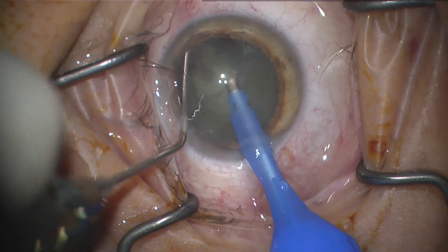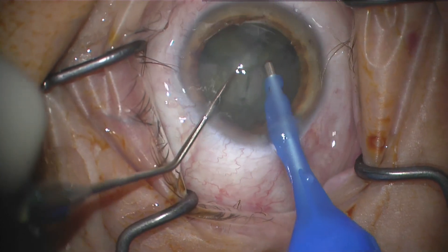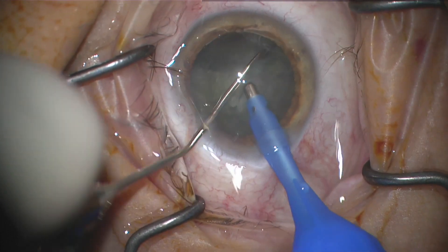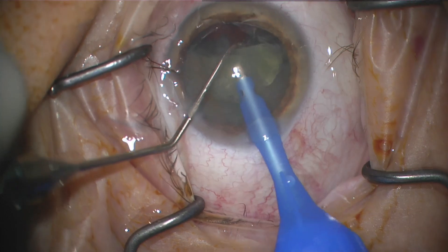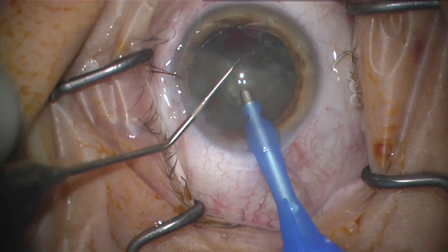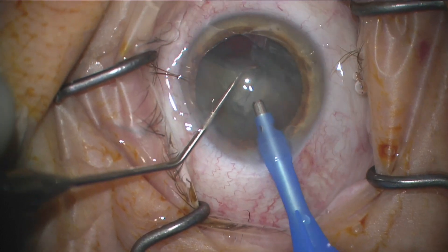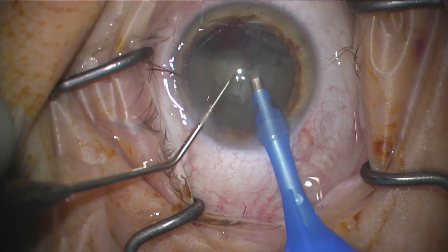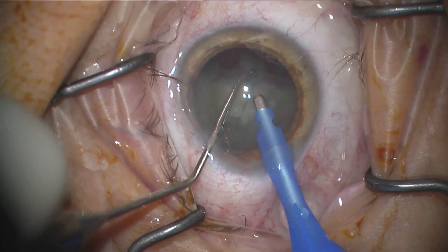Here I am chewing into the piece and using a lot of my chopper to bring it up. I'm a little conservative on the throttle — they call it the throttle, it's a little trigger on the handpiece that you push down on to aspirate the piece and then activate the cutter. I've been careful because I have seen cases with a lot of post-op corneal edema in some colleagues who push the throttle as intended, so I've just been chopping it quite a bit.